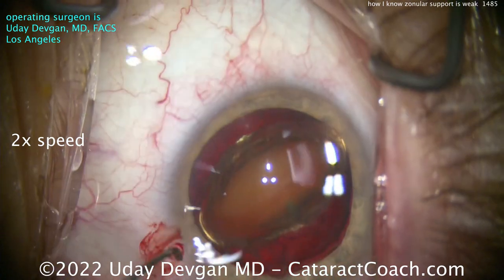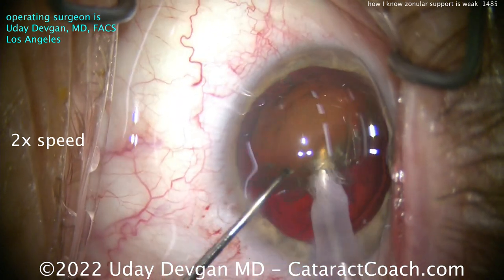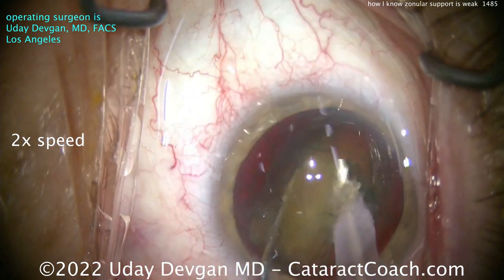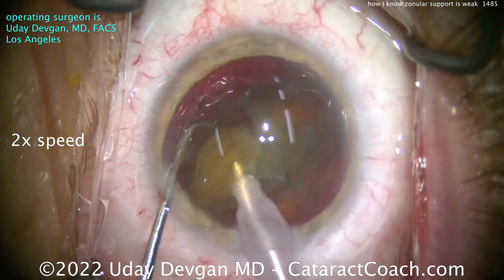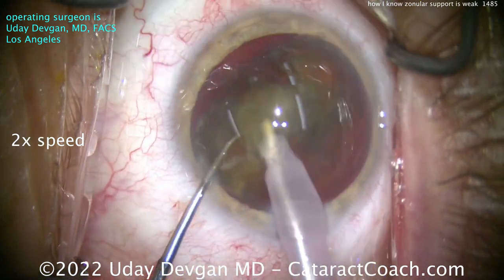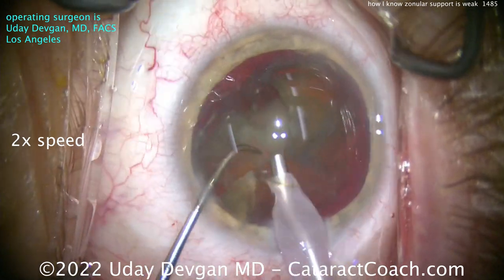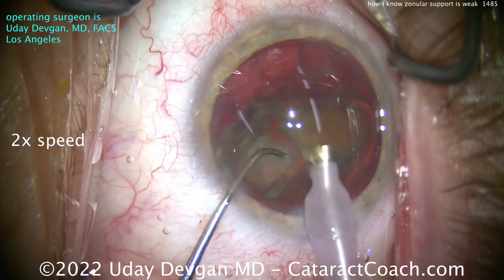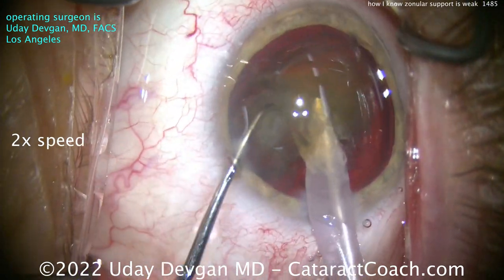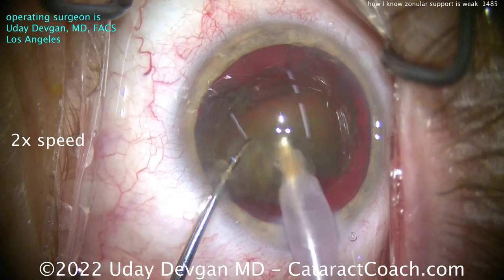Now let's chop this thing. It's reasonable nuclear density — buzz in the phaco probe, chop it in half. I like that I'm not operating within the capsular bag, so I'm not putting stress on the bag. I chopped off a little tiny sextant — we'll remove that. Using some phaco power modulations, trying to operate at the iris plane. I don't want to be too anterior; I want to stay away from that corneal endothelium. Get that chopper in there again.